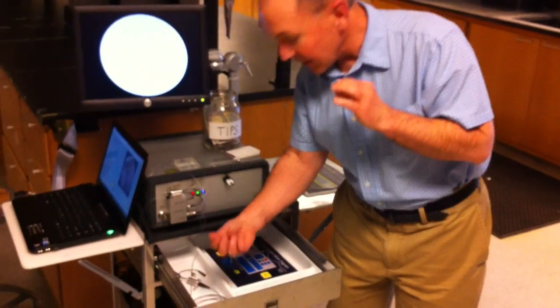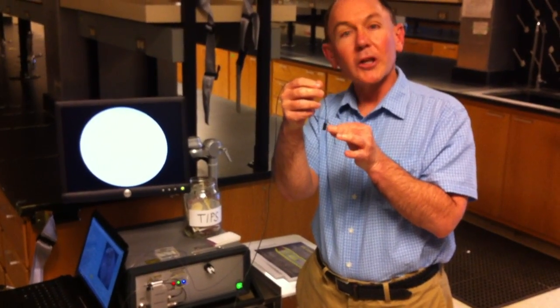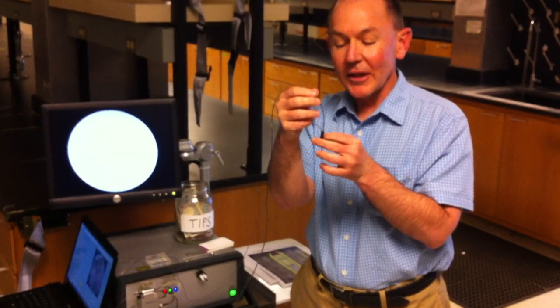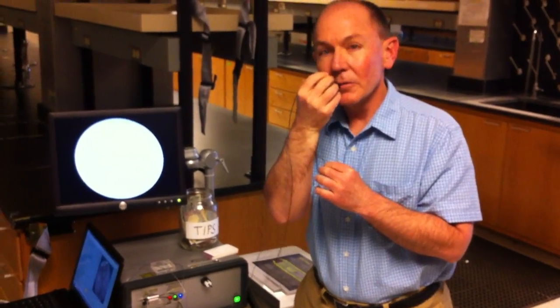And here is another example. It's exactly the same thing, but this one we just put a little capsule around. It's actually the same size as an Advil or any other capsule, and a weight in it. The idea here, put it in your mouth, drink a glass of water, and then you can image down the esophagus.